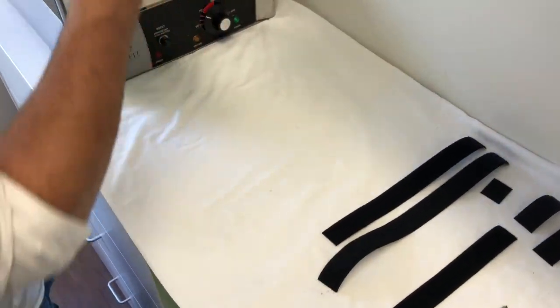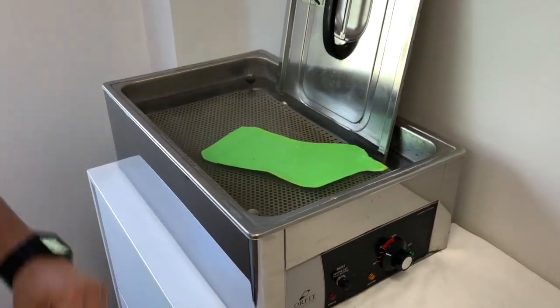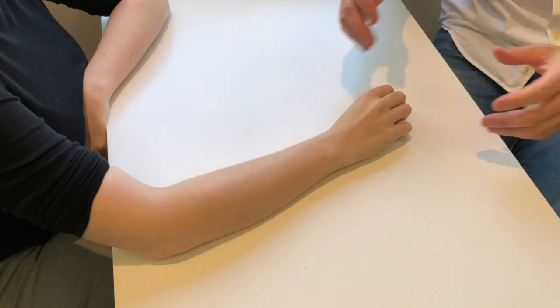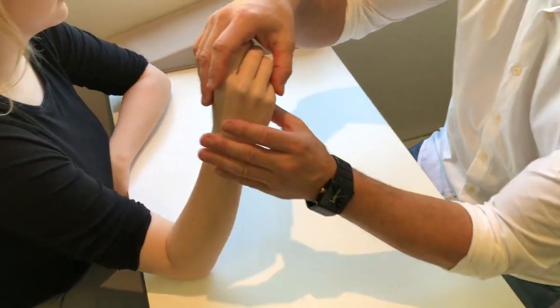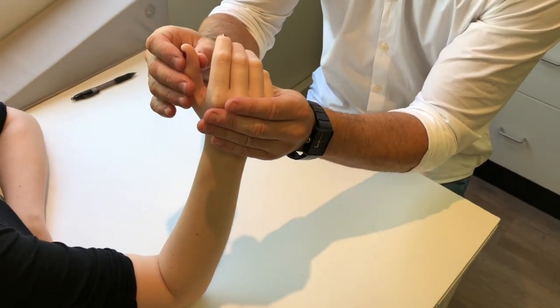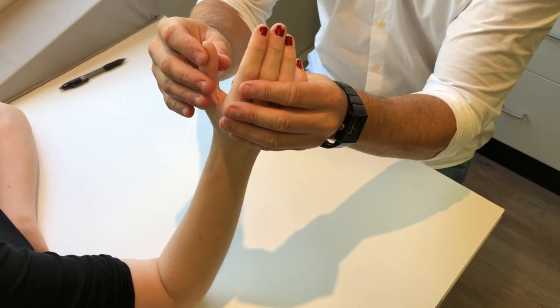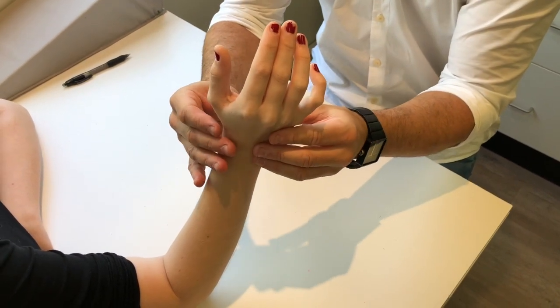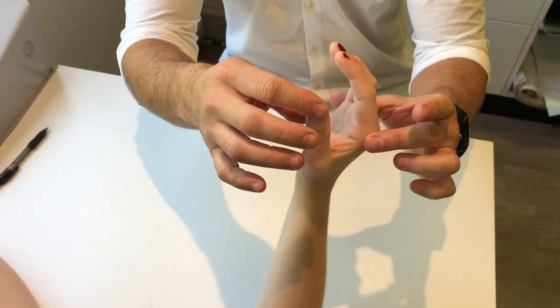So we're just putting this back in the water to heat up for the last time. While that's heating up, we're going to set up our patient. We just want the elbow resting on the table, the wrist in 20 to 30 degrees of extension. In this one we want the thumb slightly abducted and opposed so that we can get that nice position.